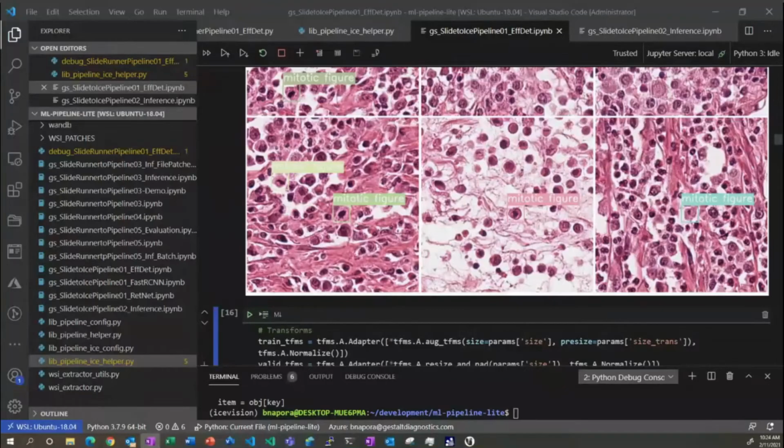But any of the human breast tissue samples that were scanned on a different type of scanner had far lower accuracy. So yeah, even the scanner type impacts the data set, and there are folks doing work on the best approach to work with that, but that's still kind of an open domain.